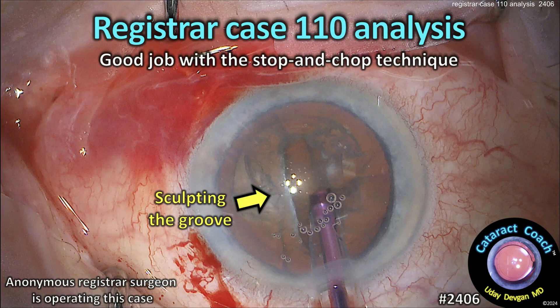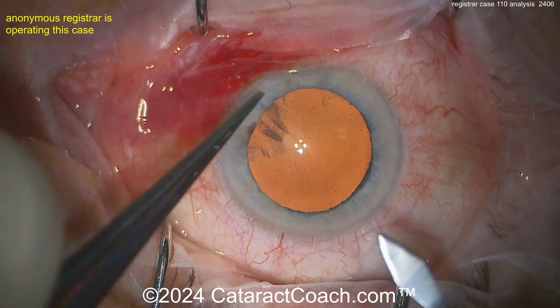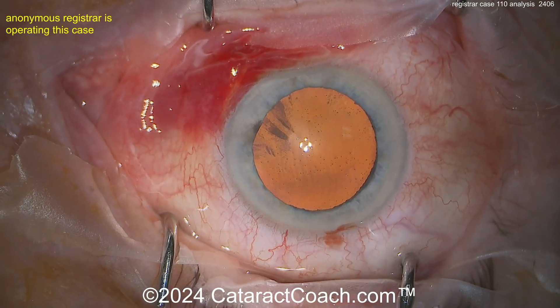CataractCoach.com registrar case 110 analysis. Good job with the stop-and-chop technique. In the USA we call them residents; in other parts of the world they may be called registrars — same concept: a young doctor in training learning a subspecialty.